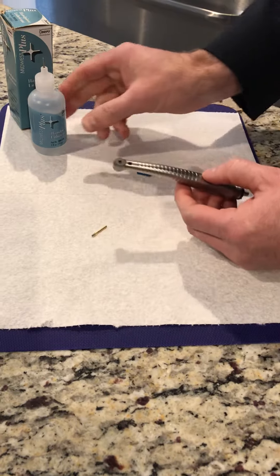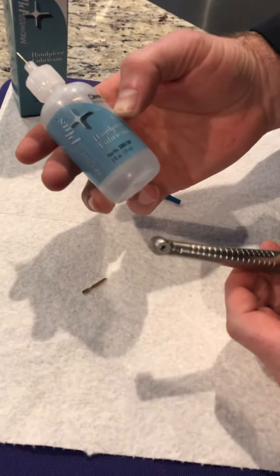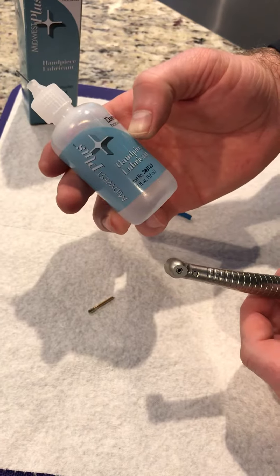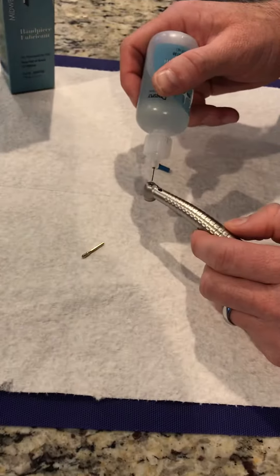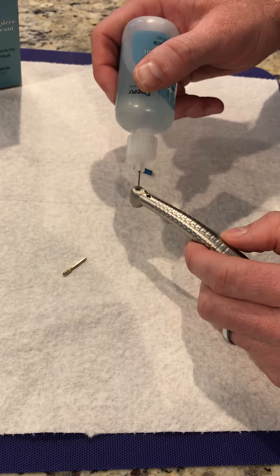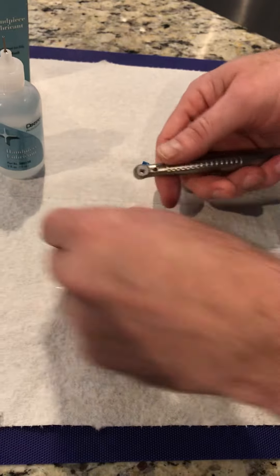When the burr comes out, get some lubricant — most offices have a bottle laying around somewhere. It is Midwest part number 380130. This is just kind of like a mineral oil. Put about five to seven drops right where the burr goes, then place your burr back in.